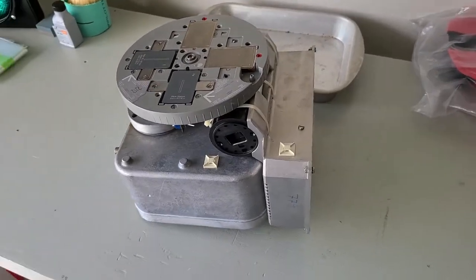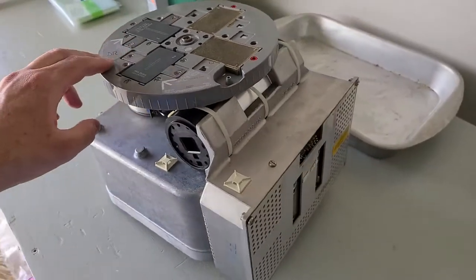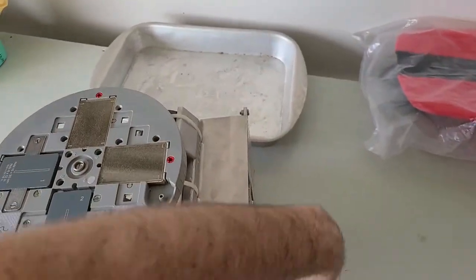Alright, so what's going on? So what I have here is an old Siemens x-ray tube unit from a dental unit. It's from a Panorex machine.